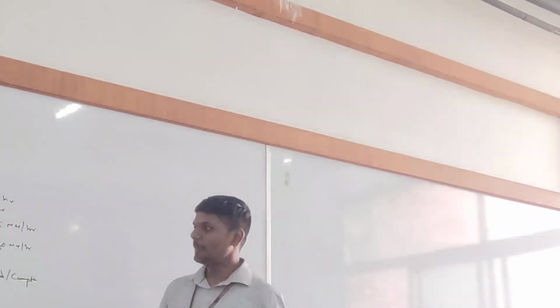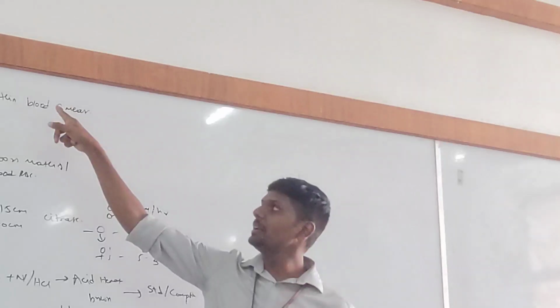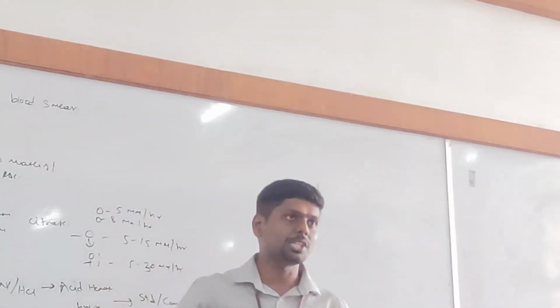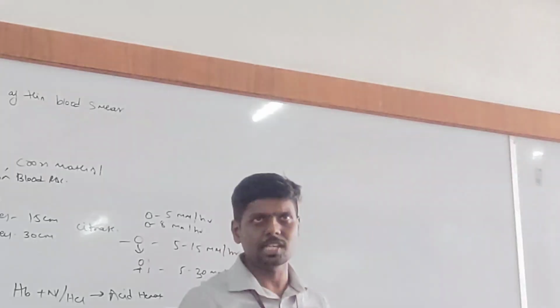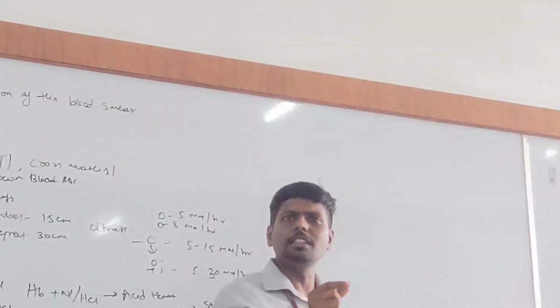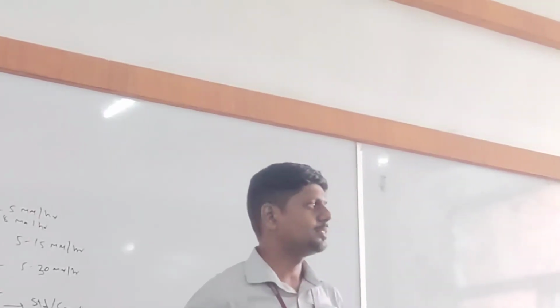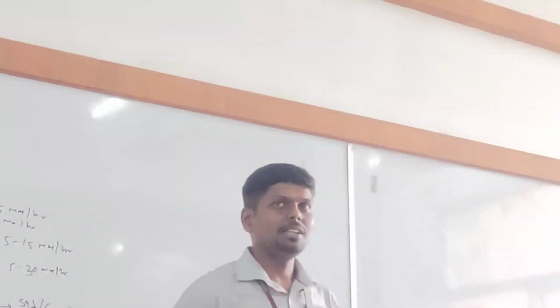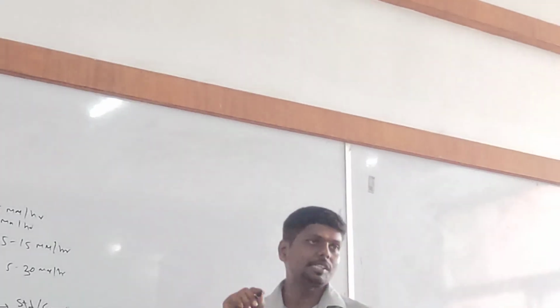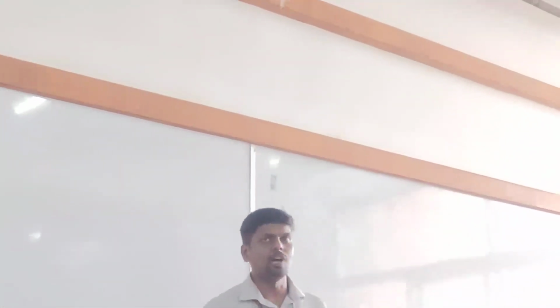Anyway, today's topic is thin blood smear preparation. What is the purpose of thin smear preparation? What do you mean by thin smear preparation? Have you prepared a thin smear so far? You have done, right? Yes. What is the purpose? To observe cells, to check the morphology.